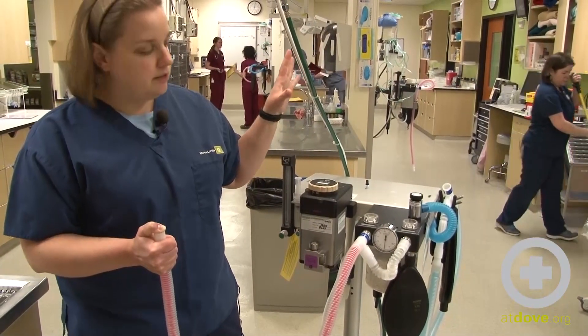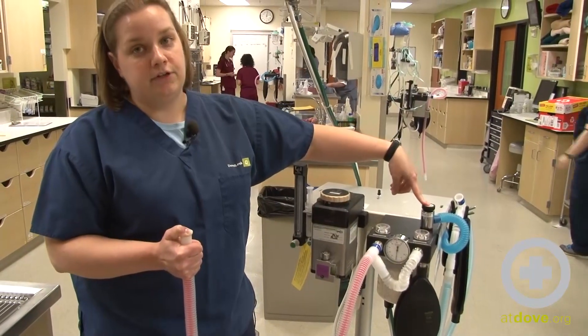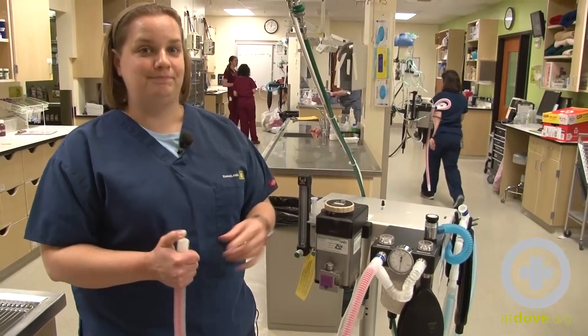This is going to make sure your system's working correctly. It also ensures that your pop-off valve is open and ready for you to start your anesthetic procedure. That's it.